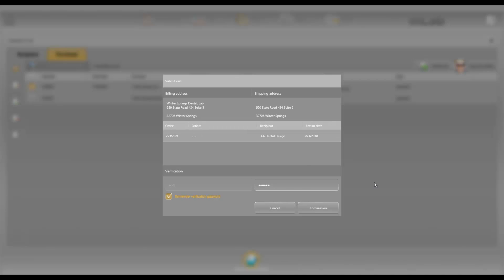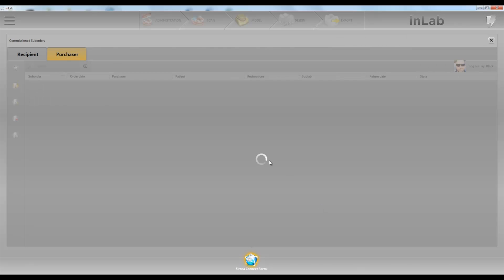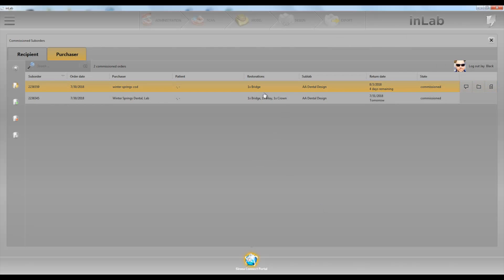Once we submit cart, my friend Frankie will get the case and go ahead and continue with the case. So that is how to send a case that was sent to you through Connect.